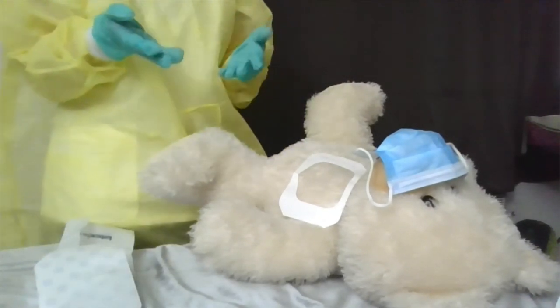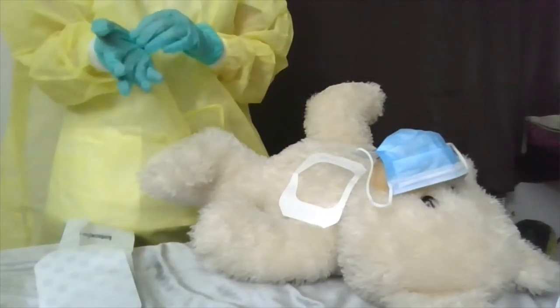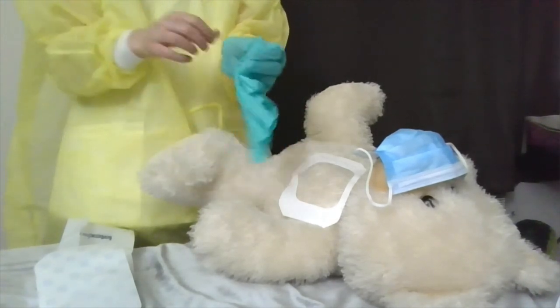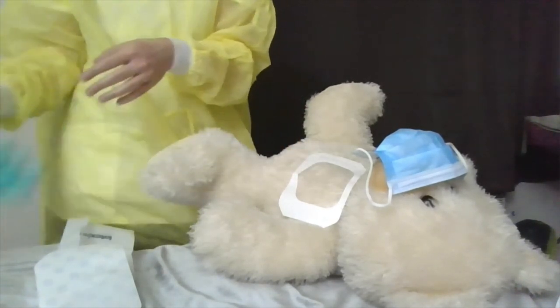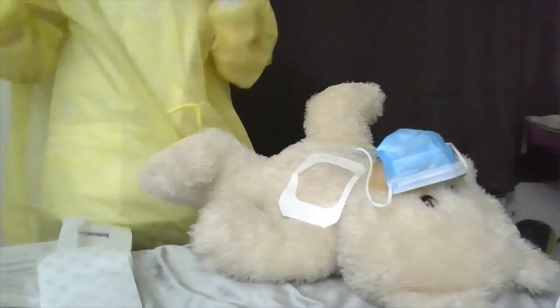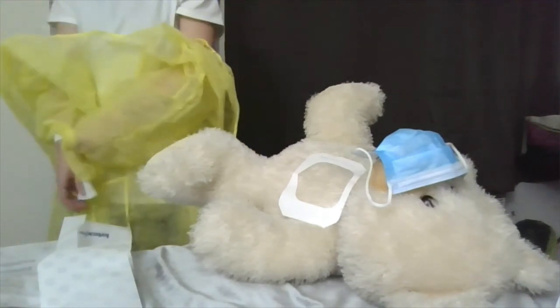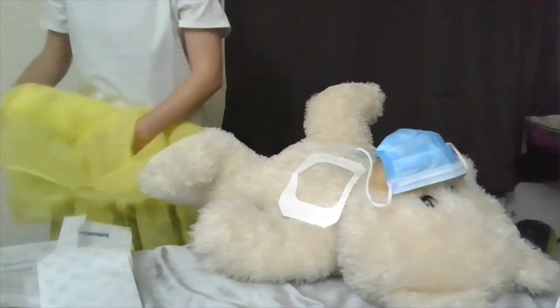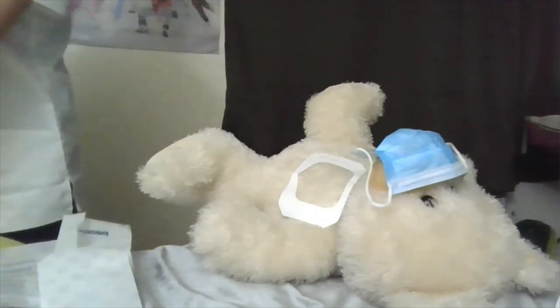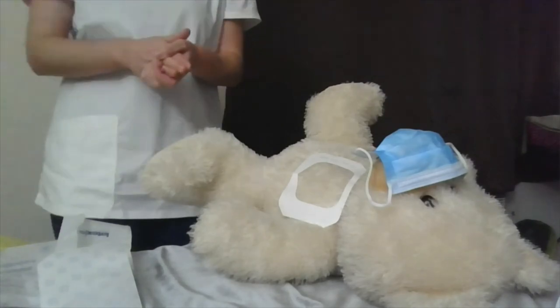If I have to change the IV, I will do so per facility protocol. I'll then remove my surgical gloves and place them in the appropriate discard receptacle. I'll remove my gown, perform hand hygiene, and document my findings.